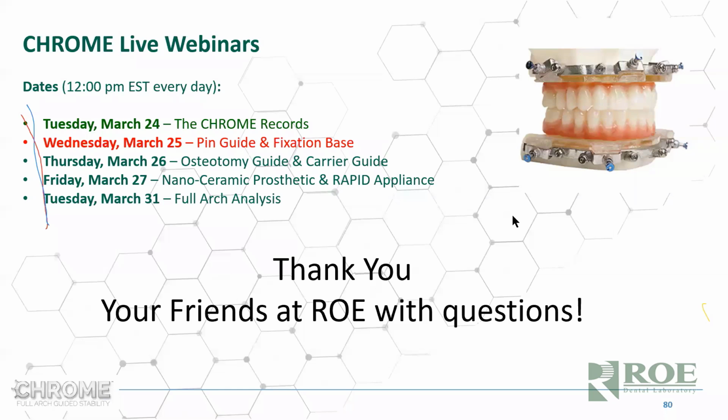The only ones I see where you have to change the settings are the old Galileos, because you have to have their aluminum cylinder to scan a denture, this special device they made, and change the settings, and the old CareStreams for sure. The old ones before the 9100, I don't really remember the number. Maybe it was a 9000, the 9000 with the stitching. You have to change the KV and the MA.